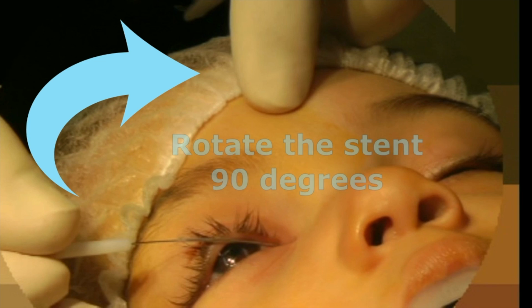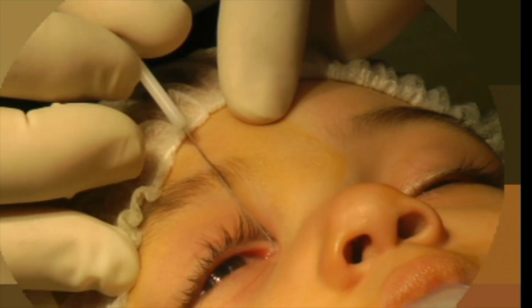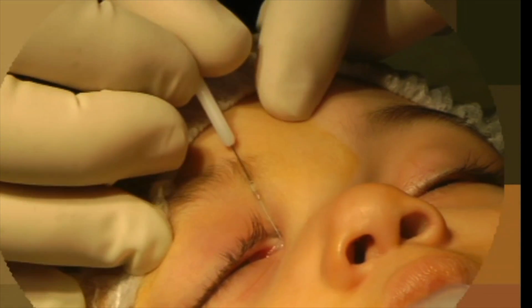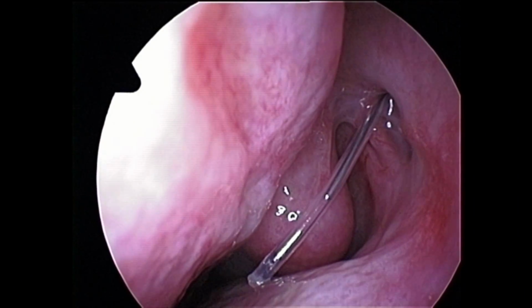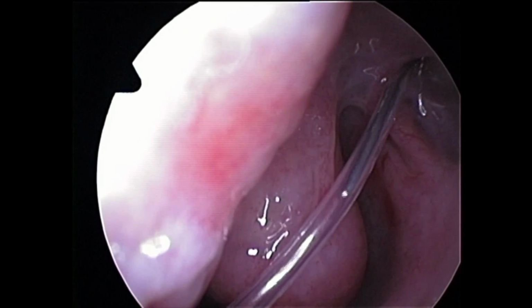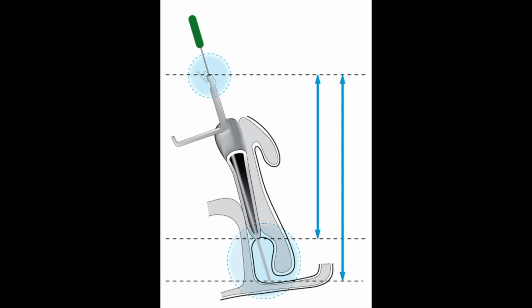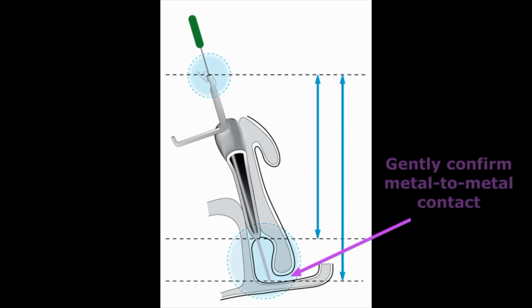Rotate the stent 90 degrees and push the stent into the nasolacrimal duct until the plug comes in contact with the punctum. The surgeon should verify proper placement of the stent endoscopically prior to removing the introducer from the stent. If not using an endoscope, gently confirm metal-to-metal contact in the nose.